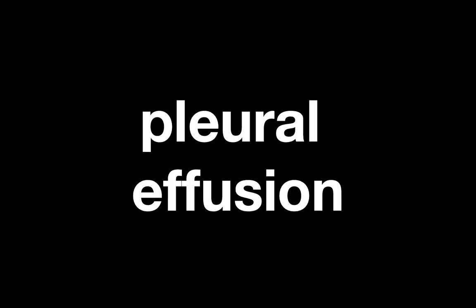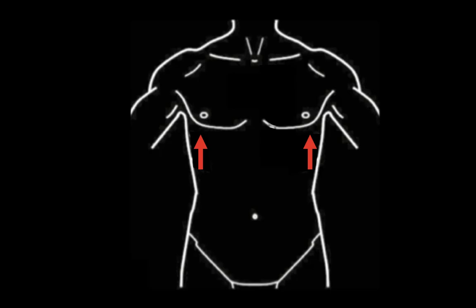We'll talk about pleural effusions next and how these look under ultrasound. They're actually pretty easy to do. You're going to put your probe in the right upper or the left upper quadrant, similar to the spots where you put the probe for the FAST exam, but slide upwards to see the diaphragm themselves. The indicator will be pointing towards the patient's head.